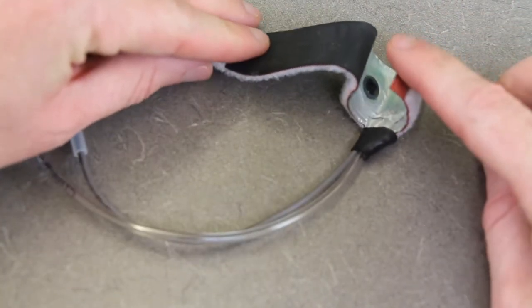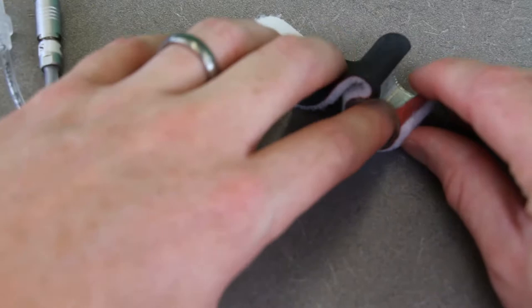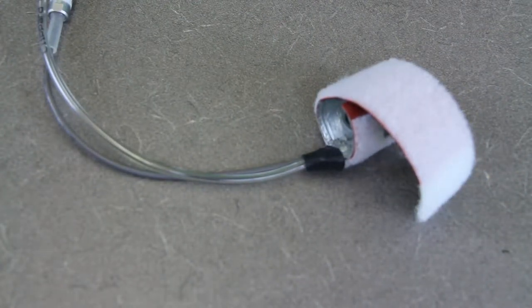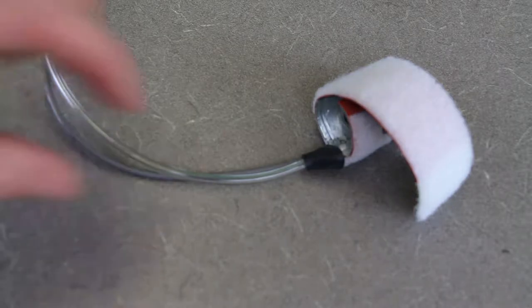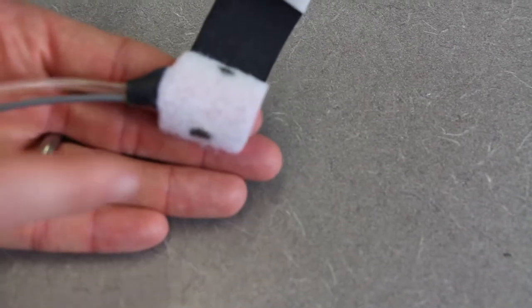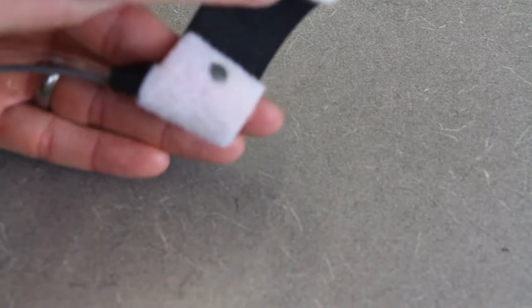Opening the cuff just enough to slide it onto the finger, you can see that shiny air bladder and also two little black sensors. One of those sensors is a light source and the other is an actual sensor. It sends light through the finger; the other senses how much light comes out. From that, it's able to determine how much blood is in the finger, and through some sophisticated math — knowing how much pressure is in the air tube — it can estimate the blood pressure inside the finger.